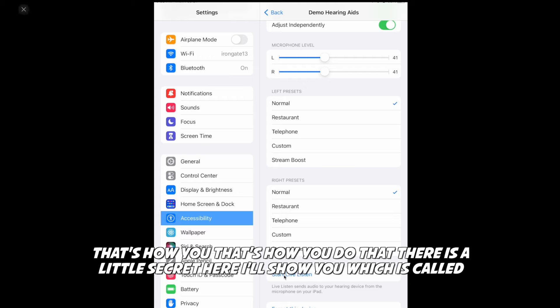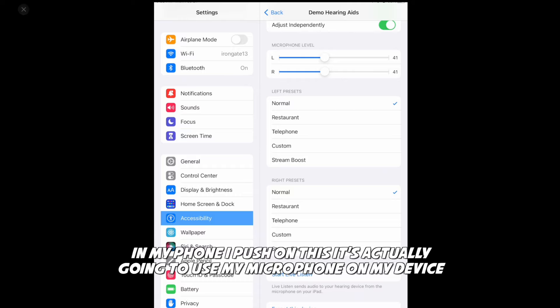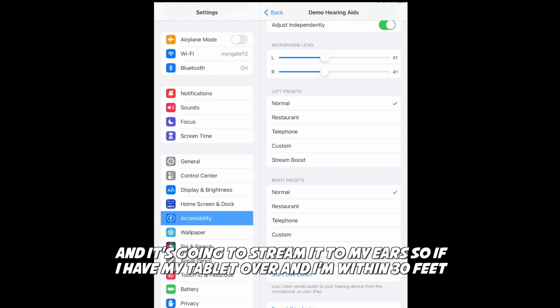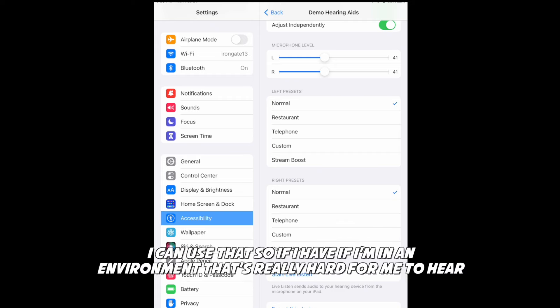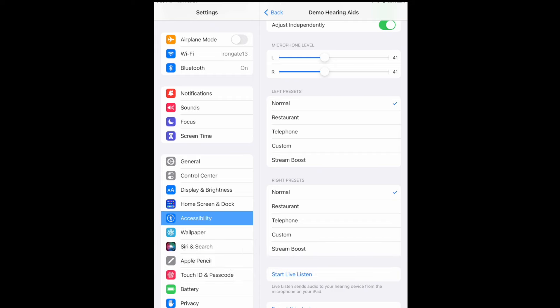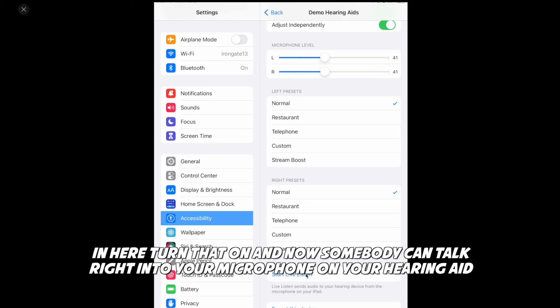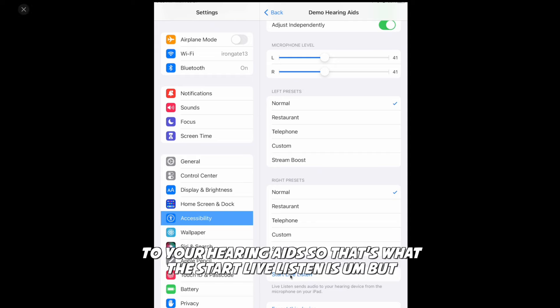There is a little secret here called Start Live Listen. What Start Live Listen does is if I have this turned on and tap it, it's actually going to use the microphone on my device and stream it to my ears. So if I'm in an environment where it's really hard to hear and I don't have any accessories, I can jump in here, turn that on, and somebody can talk right into the microphone on your phone and it's going to transmit it through Bluetooth to your hearing aid.